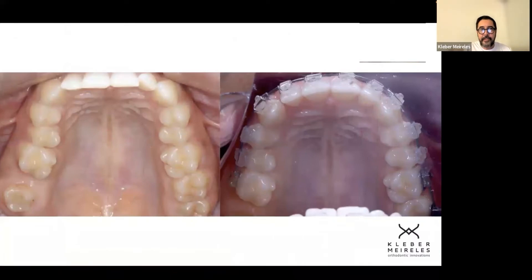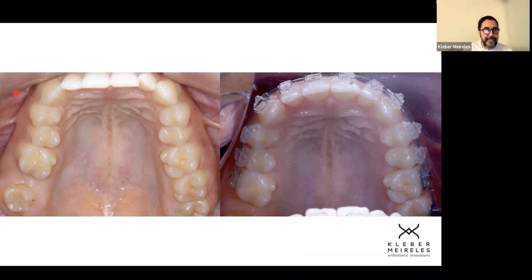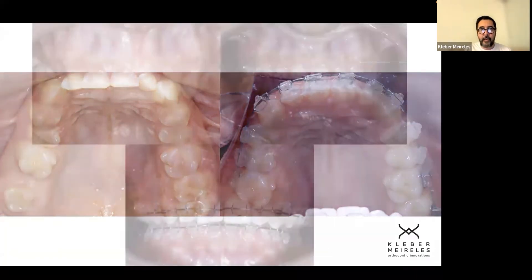And then we go on. After a while, we have a good inclination of the posterior teeth. We can see that in this posterior area, we have bone available to do this kind of buccal inclination. Otherwise, we couldn't do that — if we didn't have this amount of bone in the posterior segment, we couldn't do this kind of protrusion, because in such a case, if we did that without sufficient bone, we would have bone recession. So in this case: protrusion and buccal inclination of posterior teeth, buccal inclination of anterior teeth, and we go on with decompensation.